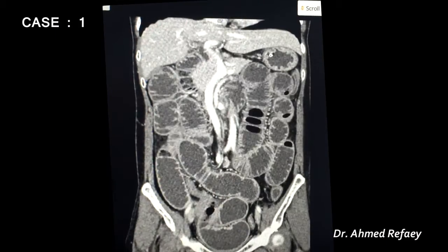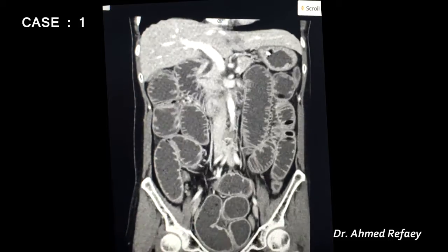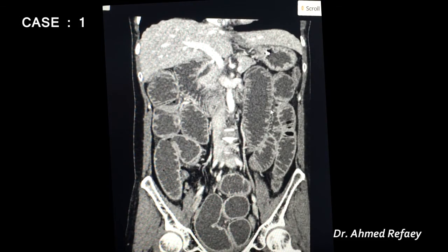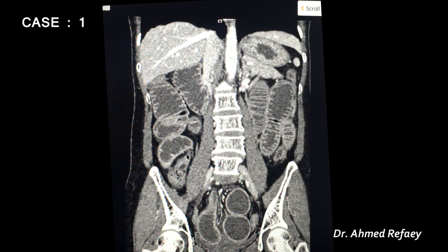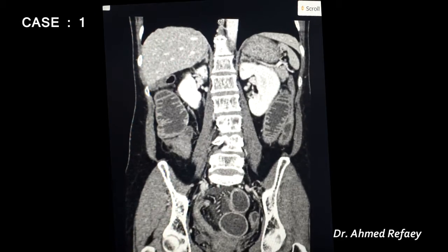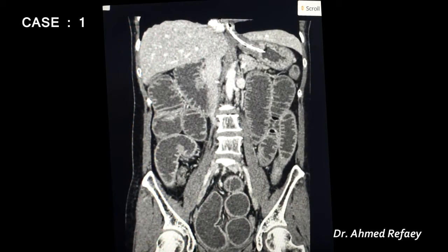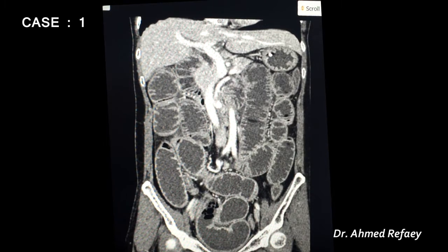Coronal reconstruction for the same patient reveals marked dilatation of small bowel loops with valvulae conniventes — the characteristic mucosal folds of the small bowel. In the lower abdomen, we appreciate the transition zone between the normal-calibre distal loops and the proximal dilated loop. Inside the proximal dilated loop, the small bowel feces sign is visible, helping localize the transition zone just proximal to the obstruction.